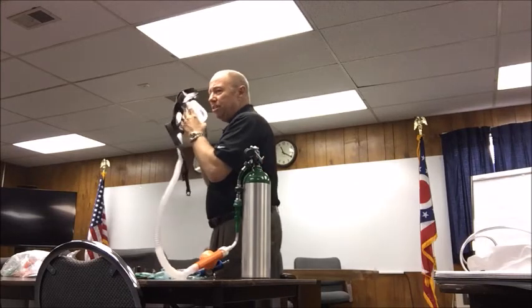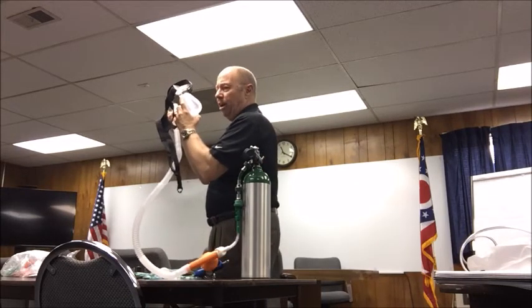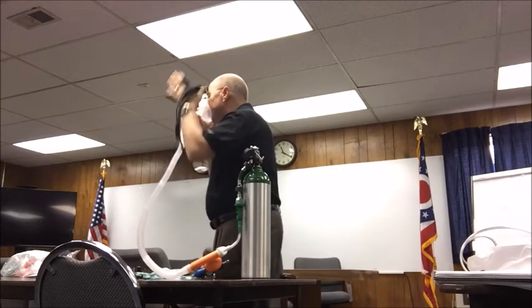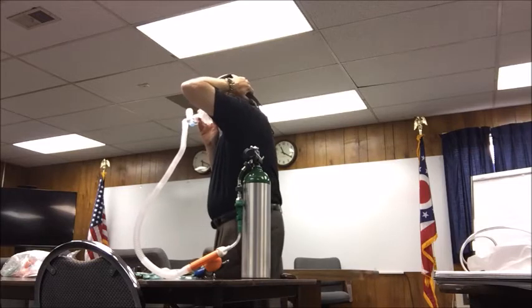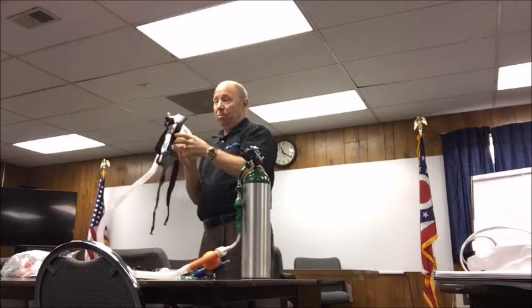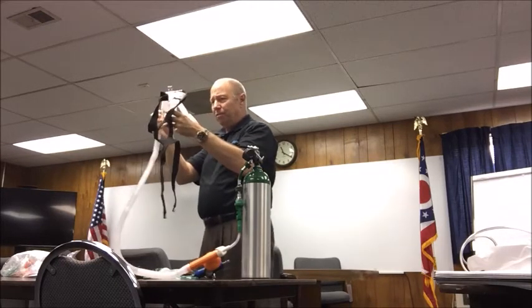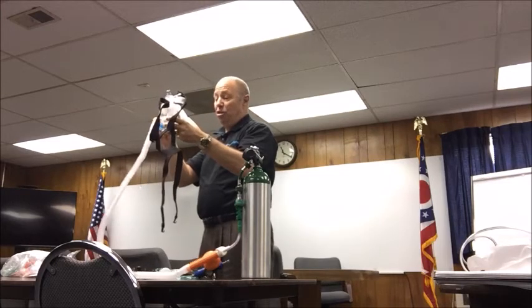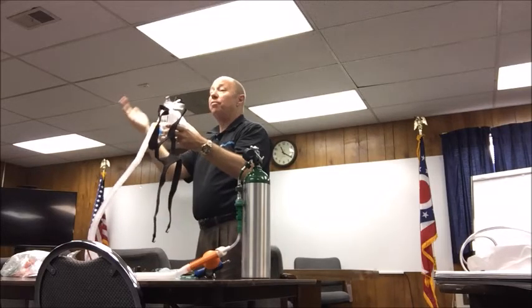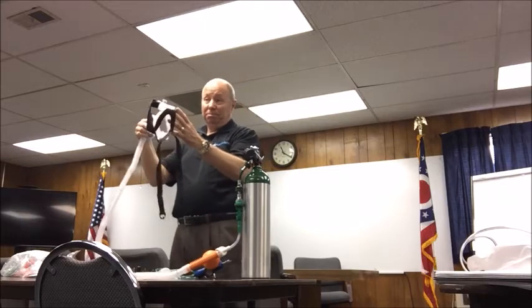Now, one of the things that's important, watch this when I breathe. This is where the oxygen, this is the relief valve. So look at it. Can you see it go up and down? There's another diagnostic tool. I'm watching the patient breathe. For whatever reason, if I lose that or don't see that, and the new ones will be orange so we can see it, you need to figure out what's going on. So that's how simple it is.